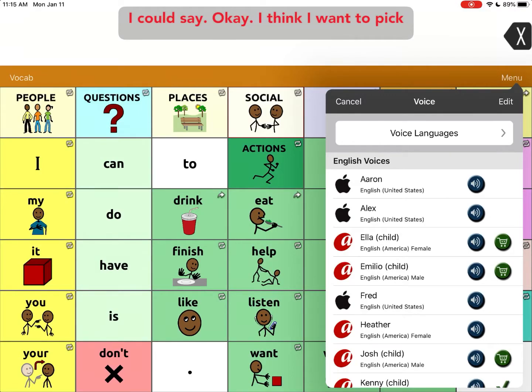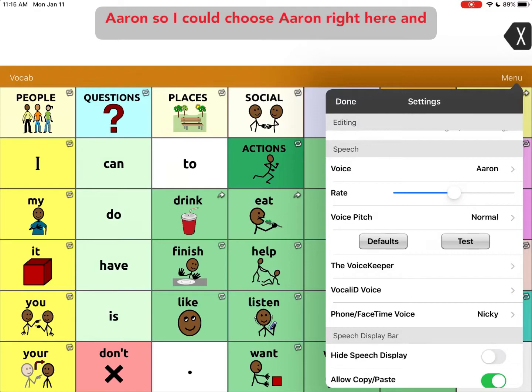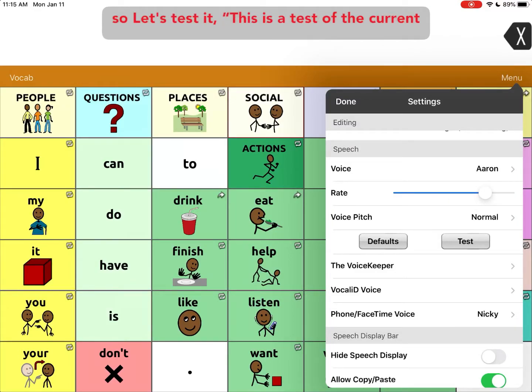I think I want to pick Aaron, so I'll choose Aaron right here. You can even change the rate — how fast it speaks.